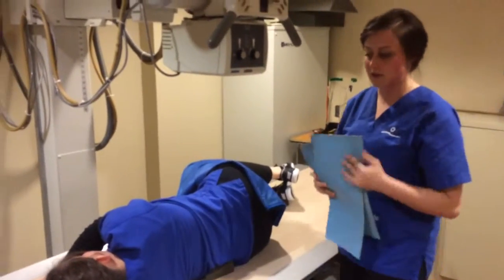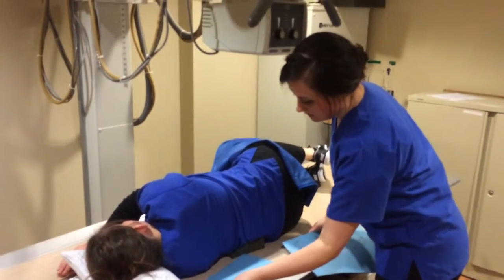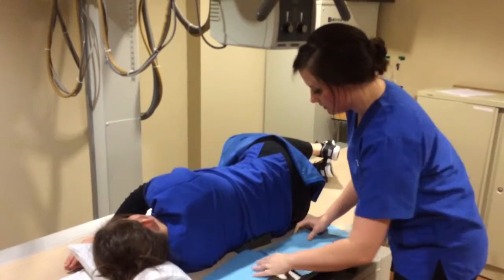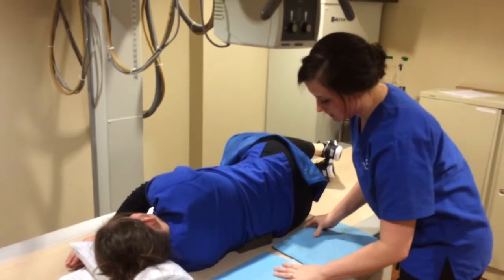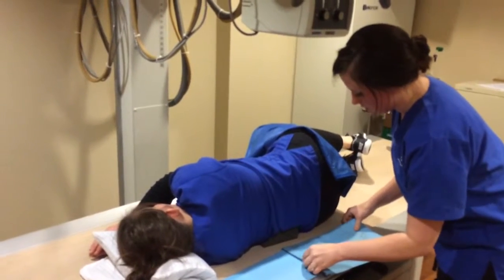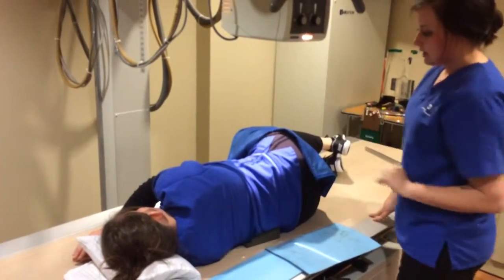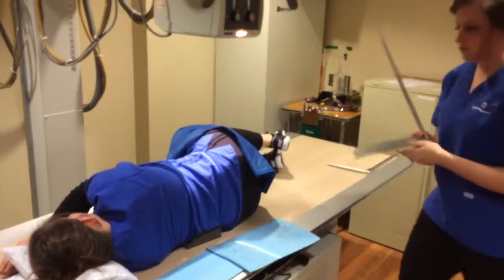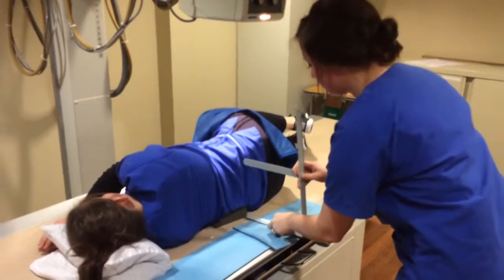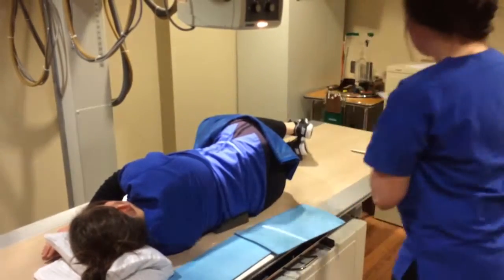This will just gather any extra radiation so that it doesn't go straight down to the IR, distorting the beam, and you want to just put this so that it is just getting the shadow of the back of the patient and going along with the curvature of her spine. And next, I'm just going to take my calipers and measure the patient again through the path of the central ray, which is about a 26.